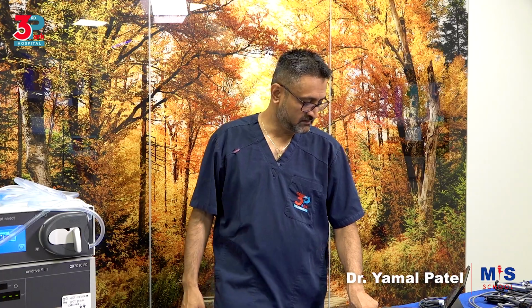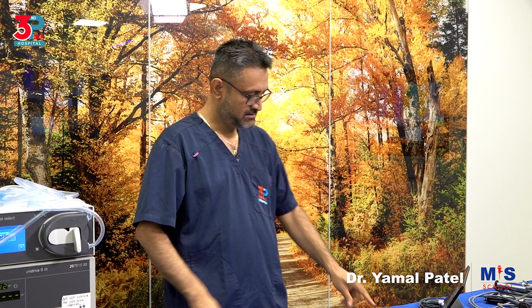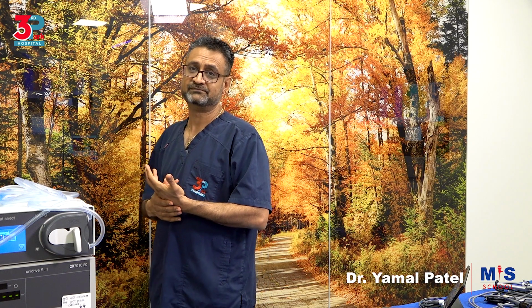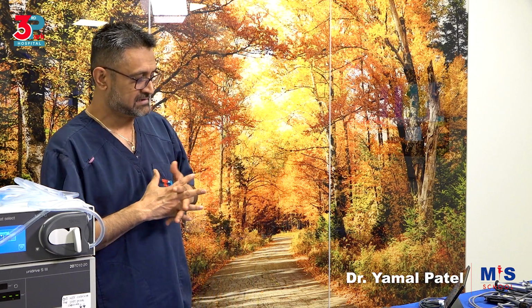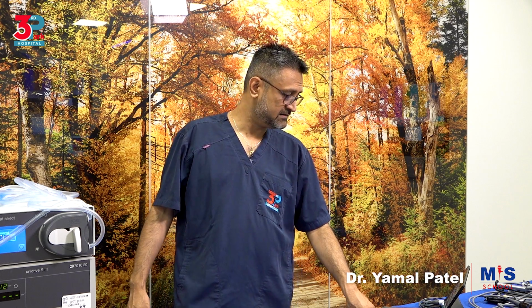hysteroscopic guided removal of displaced or lost IUCD or retained products of conception, or let's say foreign bodies like old bone fragments, spicules, hysteroscopic biopsy for postmenopausal bleeding, hysteroscopic tubal occlusion for family planning by using an Essure occlusion device, the micro insert.